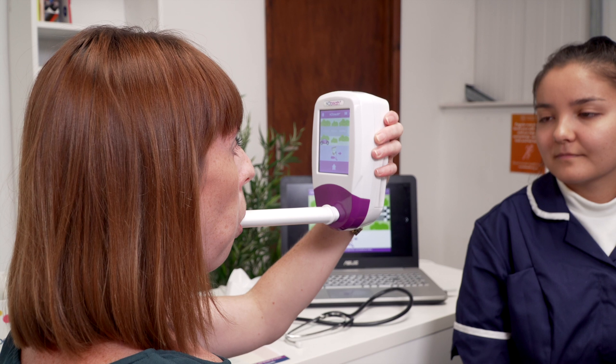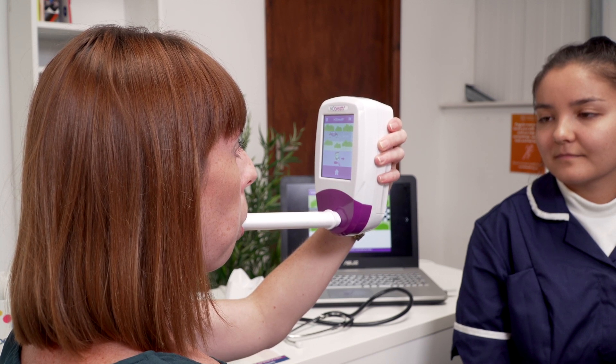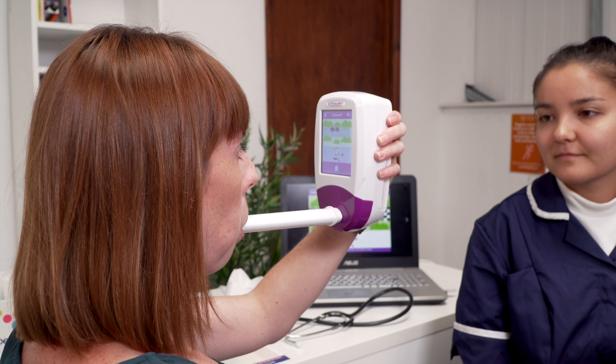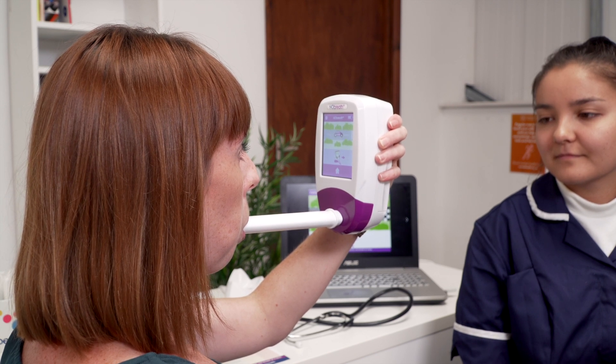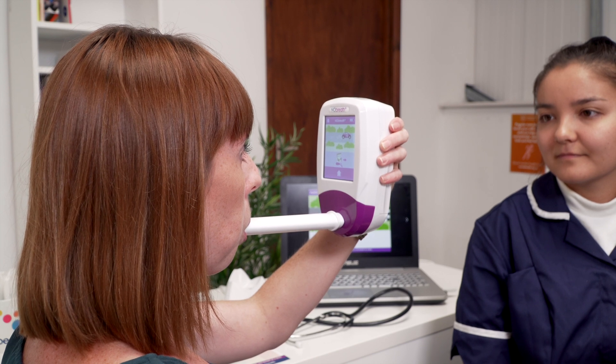Take a deep breath and when the exhale icon appears, keep the monitor upright and blow gently into the mouthpiece, making sure you do not cover the vent holes. The on-screen flow meter will guide you on the exhalation rate.